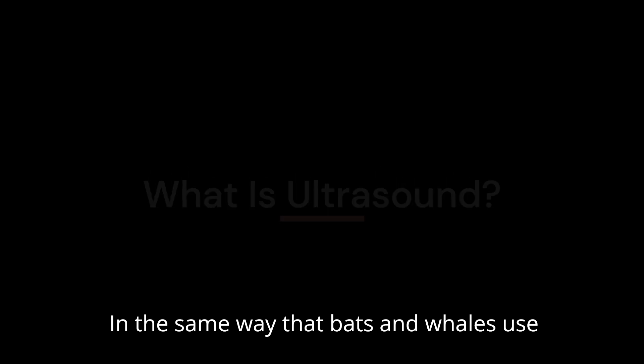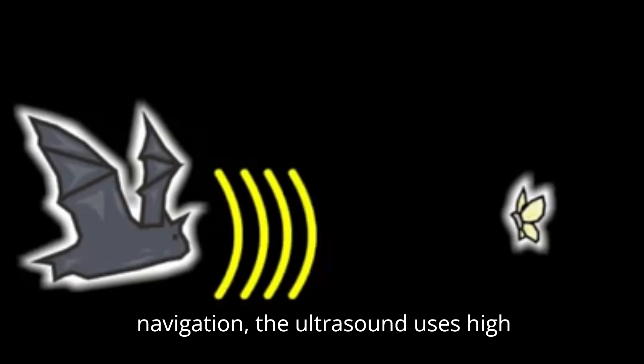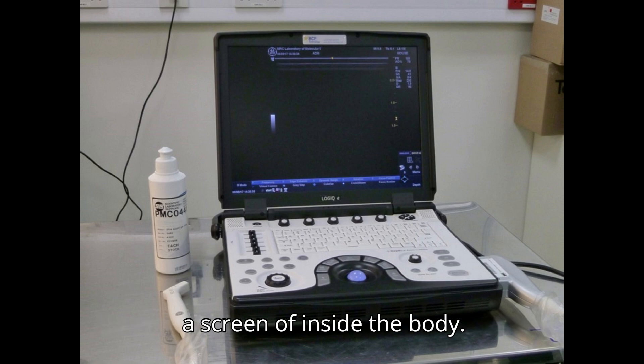In the same way that bats and whales use echolocation to locate prey or for navigation, ultrasound uses high-frequency sound waves to create images on a screen of inside the body.